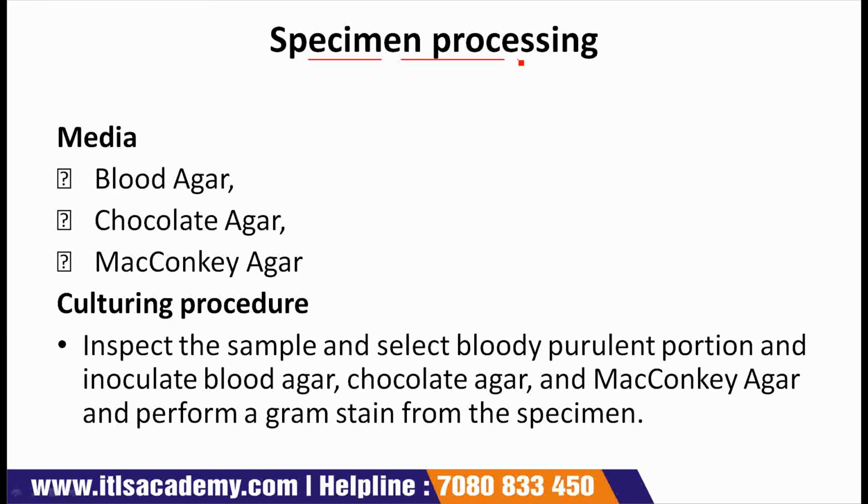Specimen processing. Media for specimen processing include blood agar, chocolate agar, and MacConkey agar. Culturing procedure. Inspect the sample and select bloody purulent portion and inoculate blood agar, chocolate agar, and MacConkey agar and perform a gram stain from the specimen.